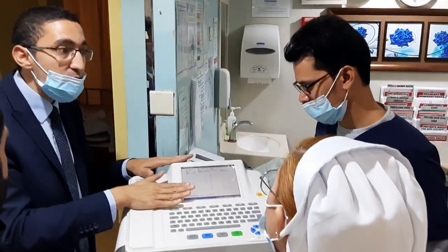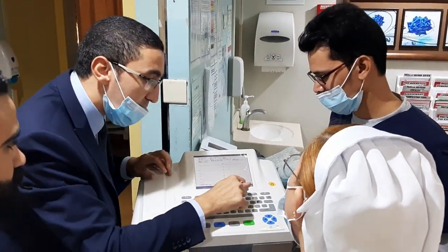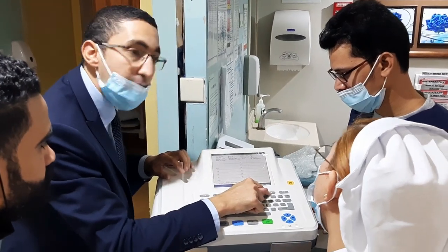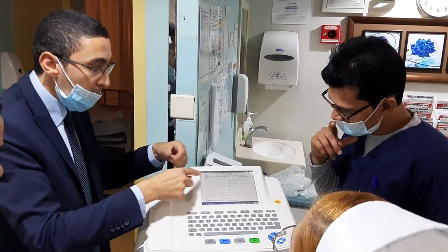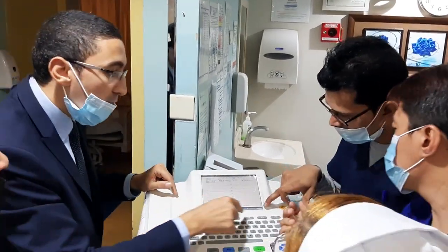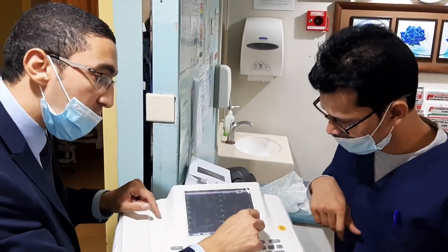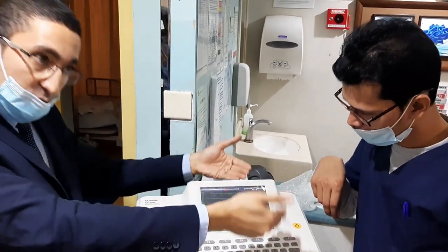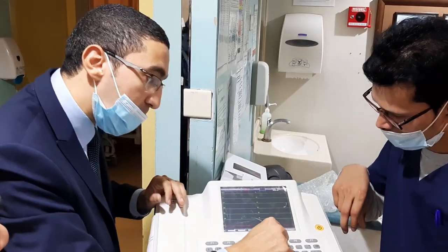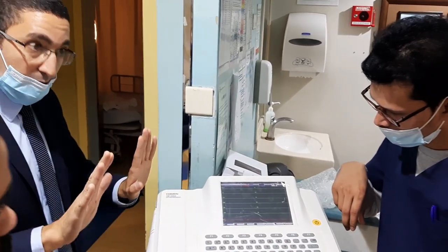If you are satisfied with this one, you can press F6 to print. If you are not satisfied, go back, so you can make it again. How to go back? It's from here, F7. You can use the touch screen or hard key, in order to save paper. So again, you press F5. You get the idea? Print the preview.